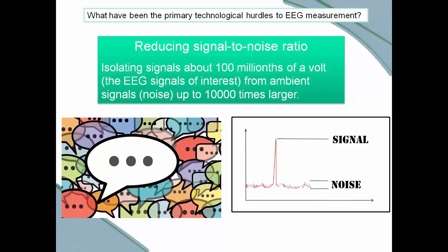Rather, we use computer technology and digital analysis to tell us which is signal and which is noise. And from the computing and from the ability to filter using digital technology and algorithms, we have a much cleaner and finer means in which we can separate signal from noise.